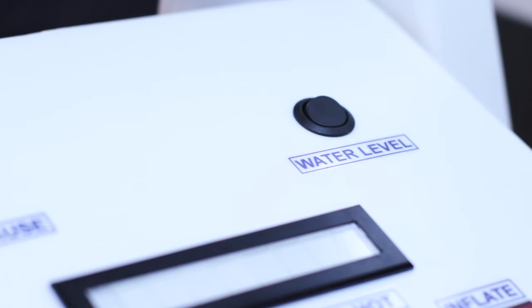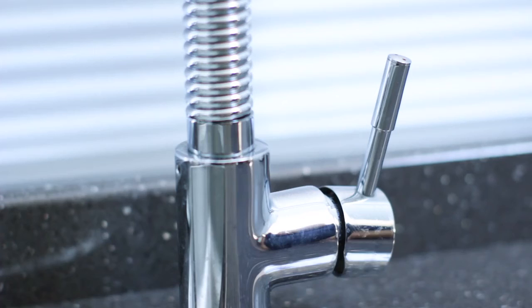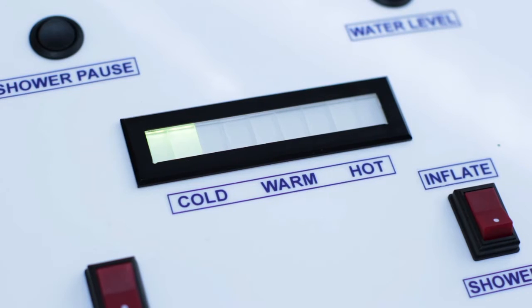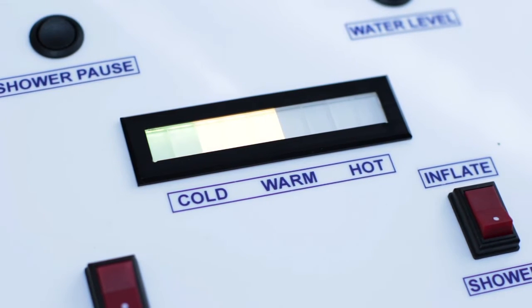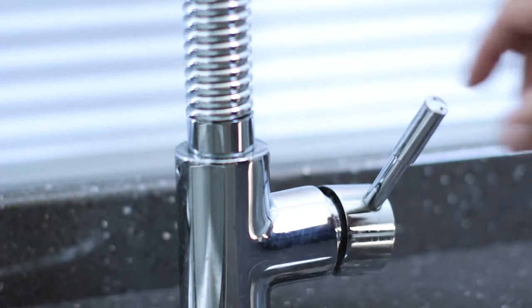Press the water level button. This will bleep and continue bleeping throughout the filling. Turn on the taps and start to fill the system. It is important you feed the hot and cold water in together. There is a temperature indicator on top of the Watergenie to help you feed in the correct temperature.